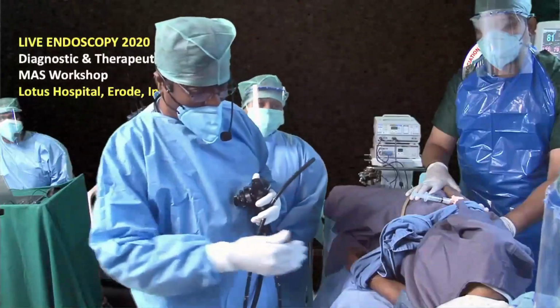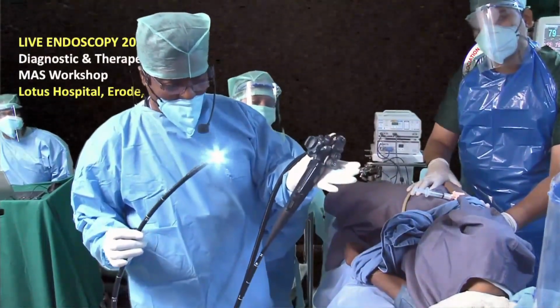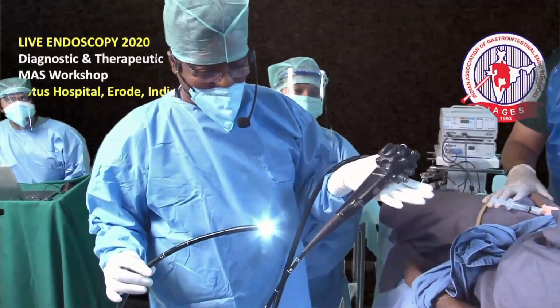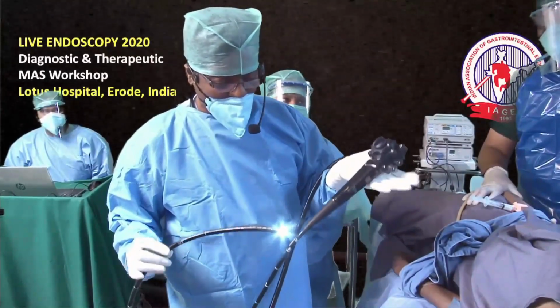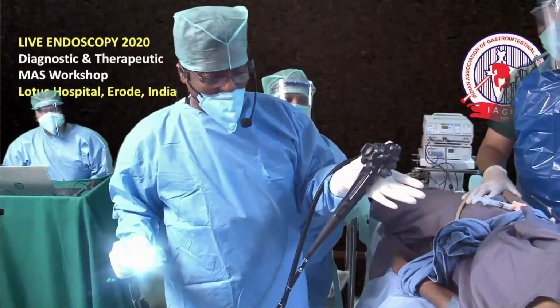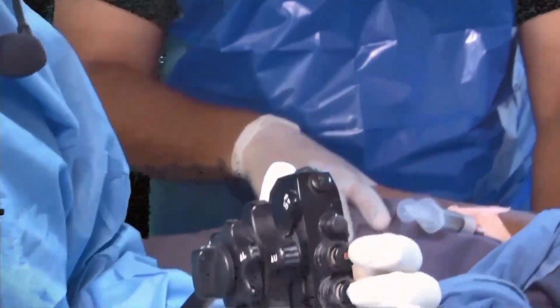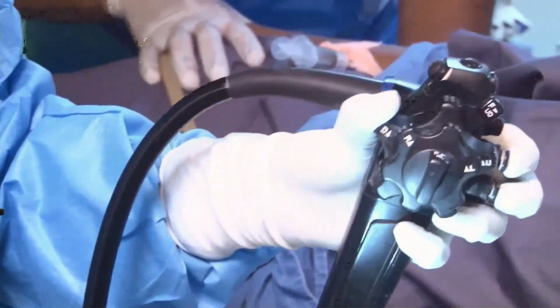about 2 feet away from him, comfortably holding the endoscope, which is an Olympus GIF H170 series, because it has the image enhancement and magnification also. It's a very good endoscope. So I'll hold the control head with the non-dominant hand, engage my 2 fingers to the button, and allot my thumb to control the wheel.